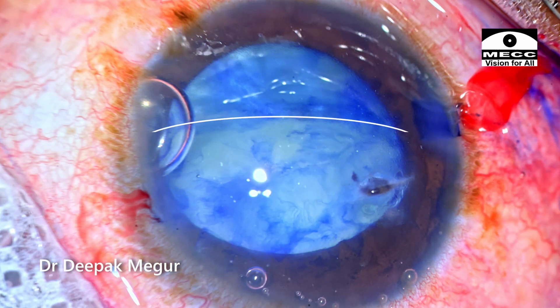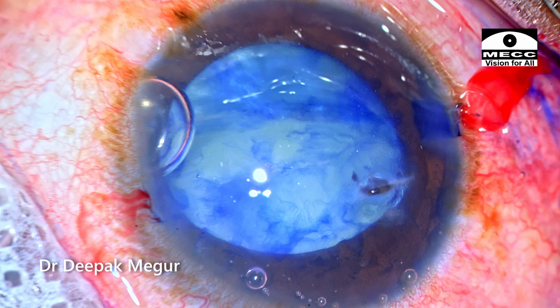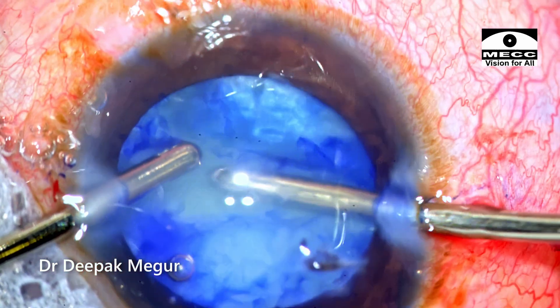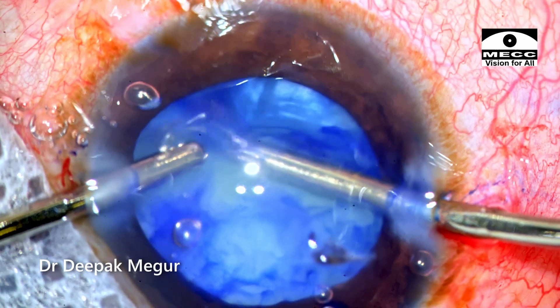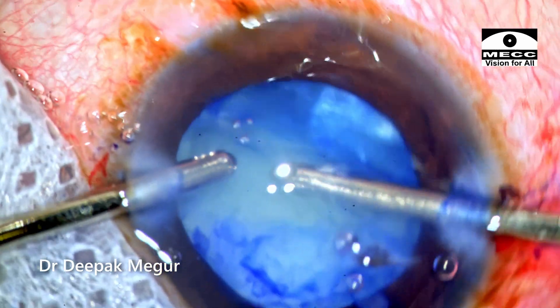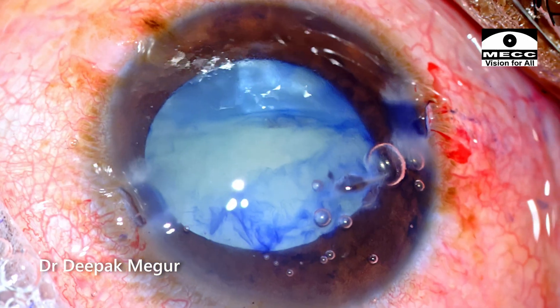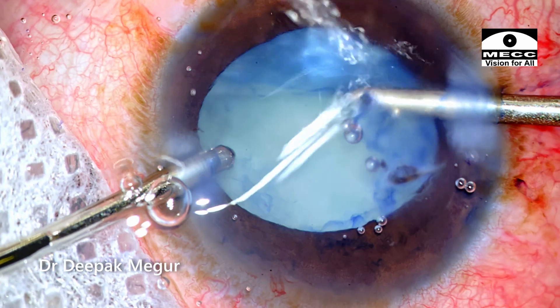The cornea is edematous. This line looks like one of the torn edges of the anterior capsule but I'm not sure where the other edge is — usually the capsule will be split equator to equator. I go in with my bimanual irrigation aspiration to aspirate out the lens matter. I'm unable to aspirate these swollen lens fibers easily; some fibers are being aspirated out but it does not look good. It should not be a problem to aspirate these swollen fibers easily.